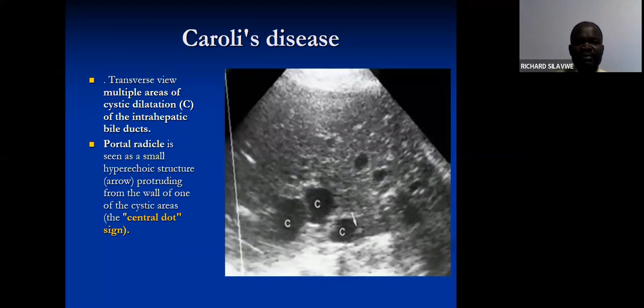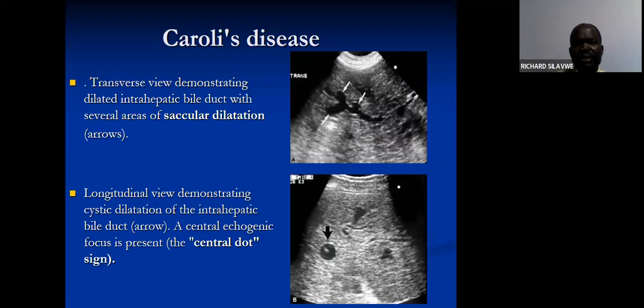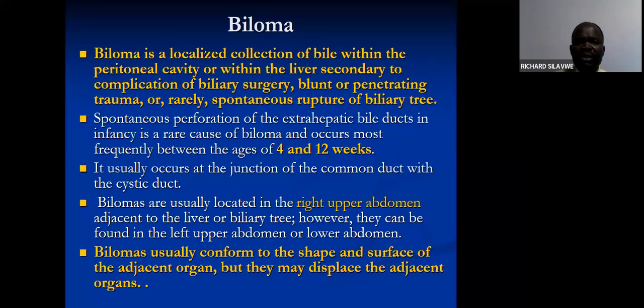So this is the transverse view. I'm just showing you a sonogram here of Caroli's disease. All these are images of Caroli's disease.